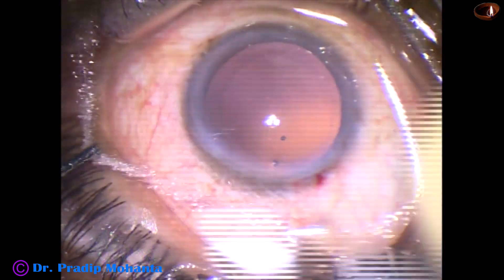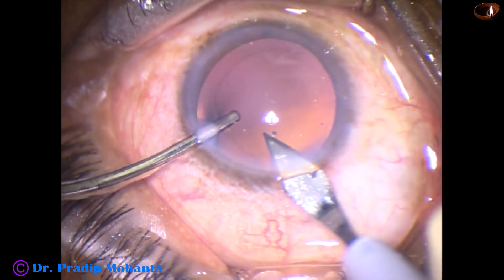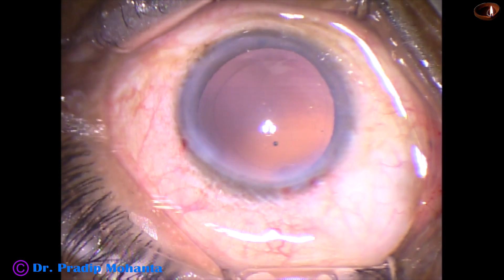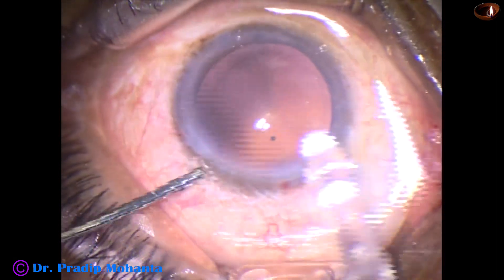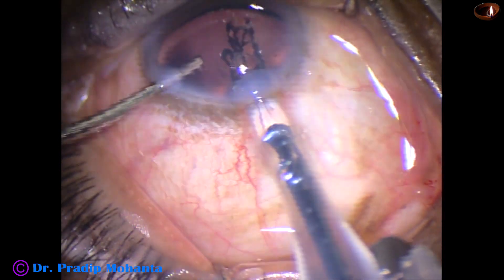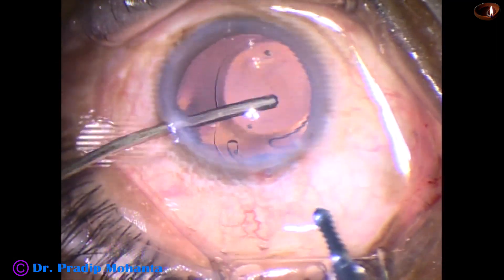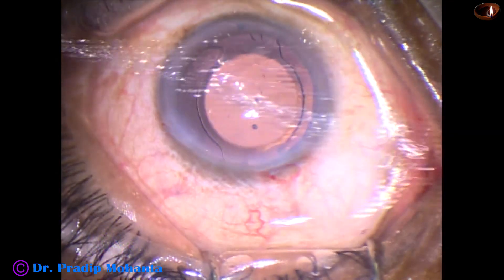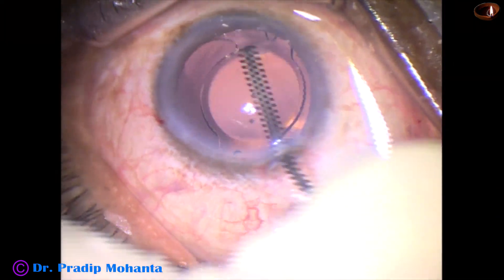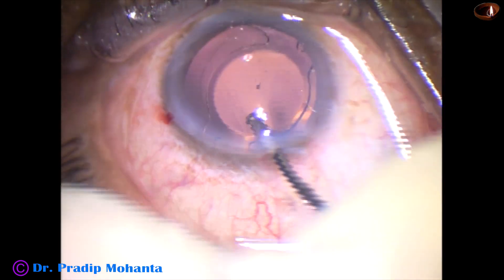And now the main wound is enlarged a little bit because a B cartridge is going to be used for implantation of the intraocular lens. This is a hydrophilic single-piece monofocal intraocular lens from Appasamy Associates — this is NASPRO. It is an aspheric lens, and it is a beautiful lens.